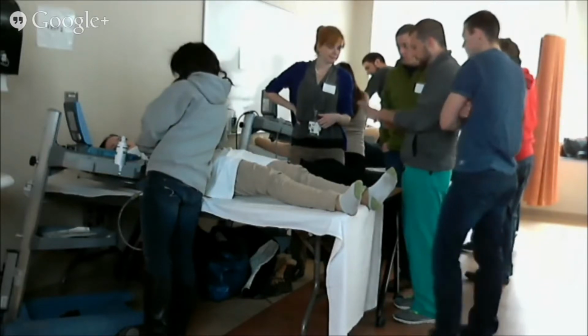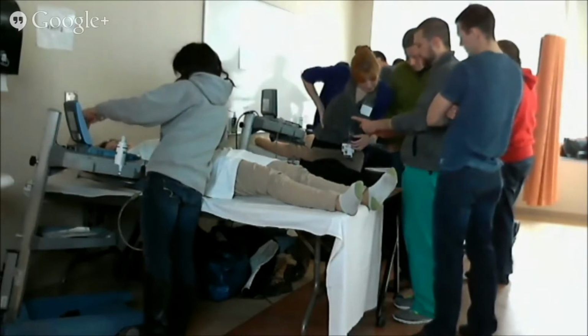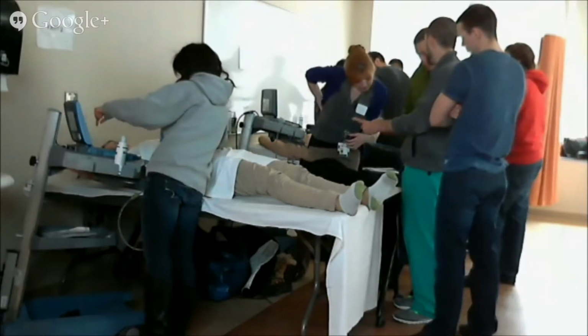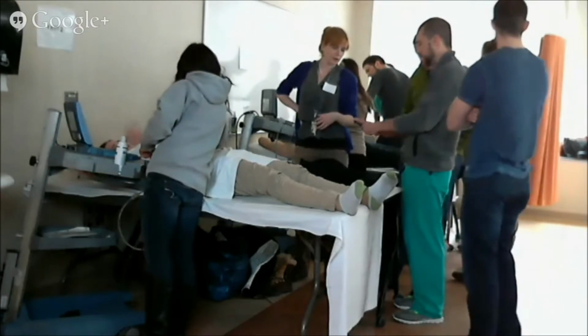Here's a picture I was talking about. The seminal vesicles, see how those seem like vesicles. Imagine if they were a little bit larger, this guy might fall in free fluid and get down into the bladder.